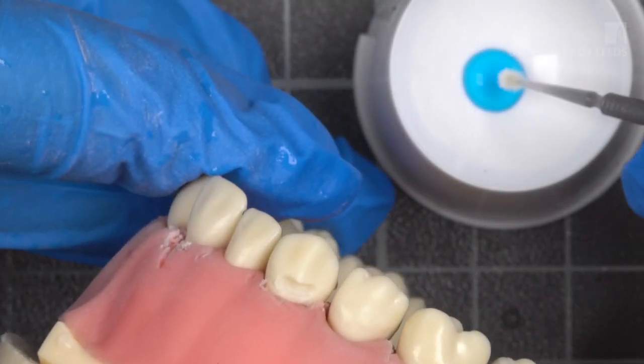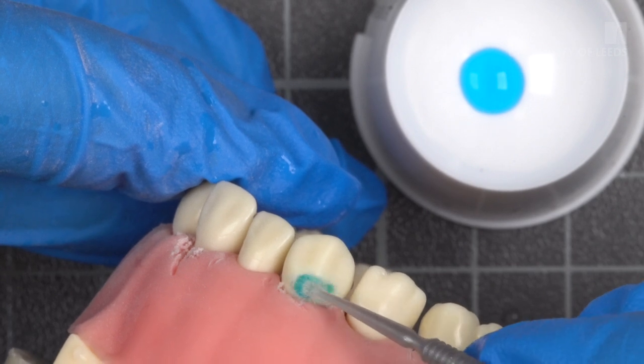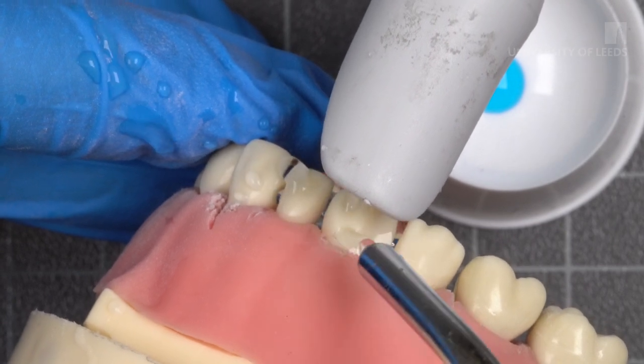Apply dentine conditioner for 10 seconds to remove the smear layer and seal the dentinal tubules. Rinse and gently dry. Do not desiccate.